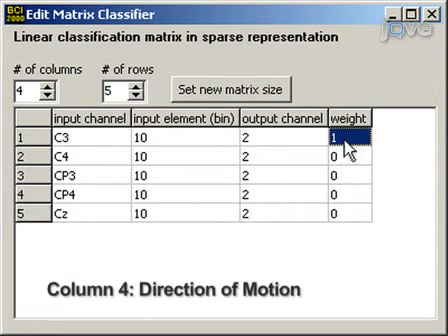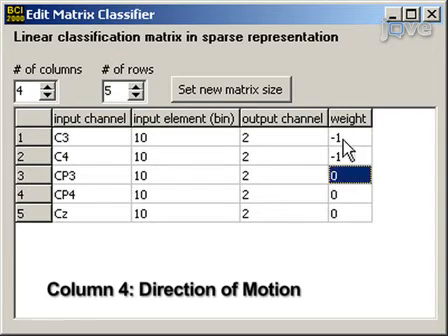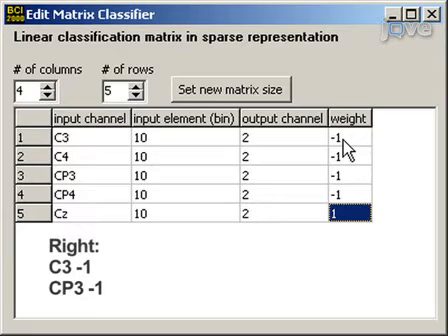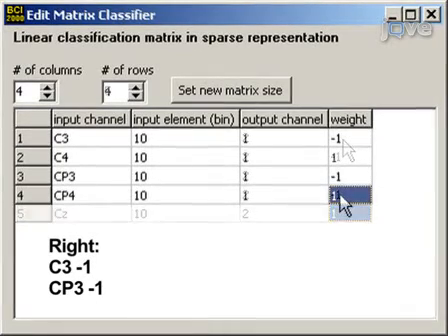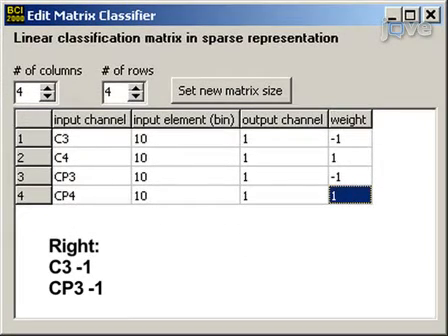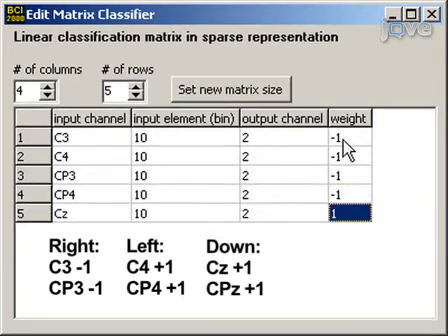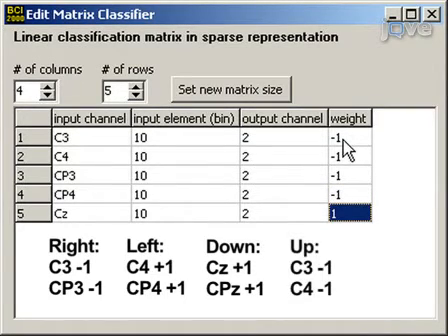Finally, in the fourth column, enter the feature weight, which corresponds to the opposite intended direction. For example, to move the cursor right, you should weight C3 and CP3 as minus 1, and to move it left, you should weight C4 and CP4 as 1. Similarly, to move the cursor down, you should weight CZ and CPZ as 1, and to move the cursor up, you should weight C3 and C4 as minus 1.